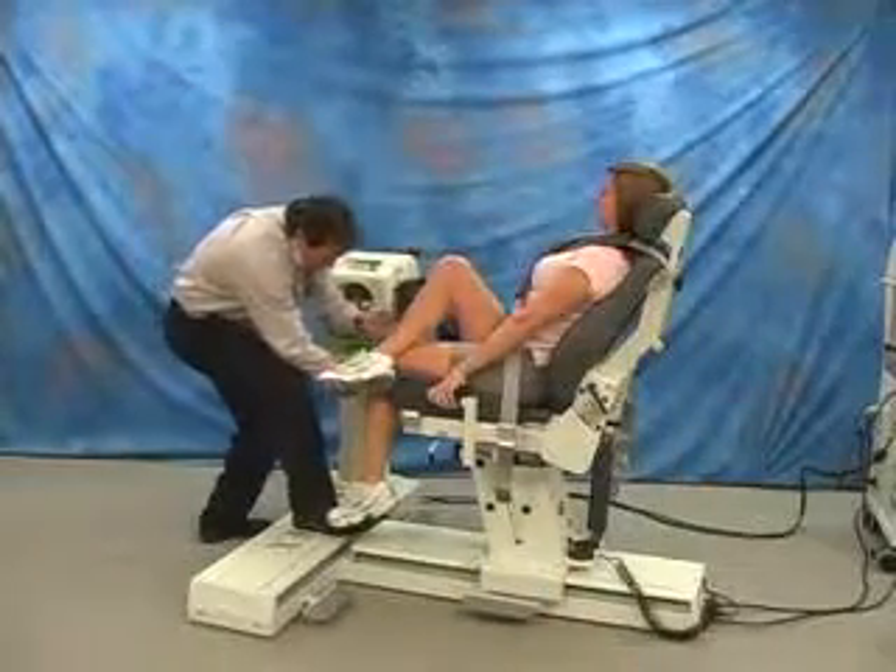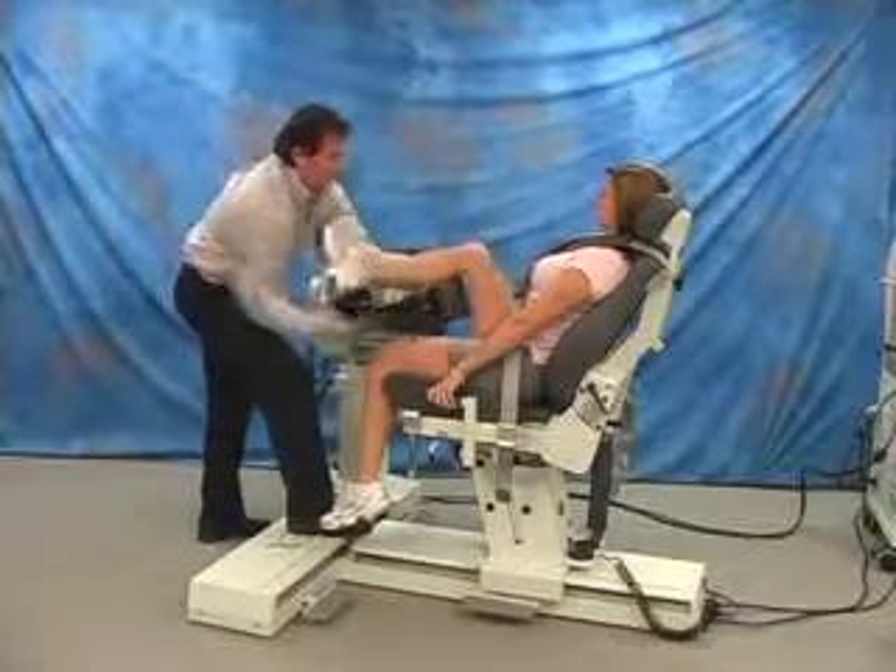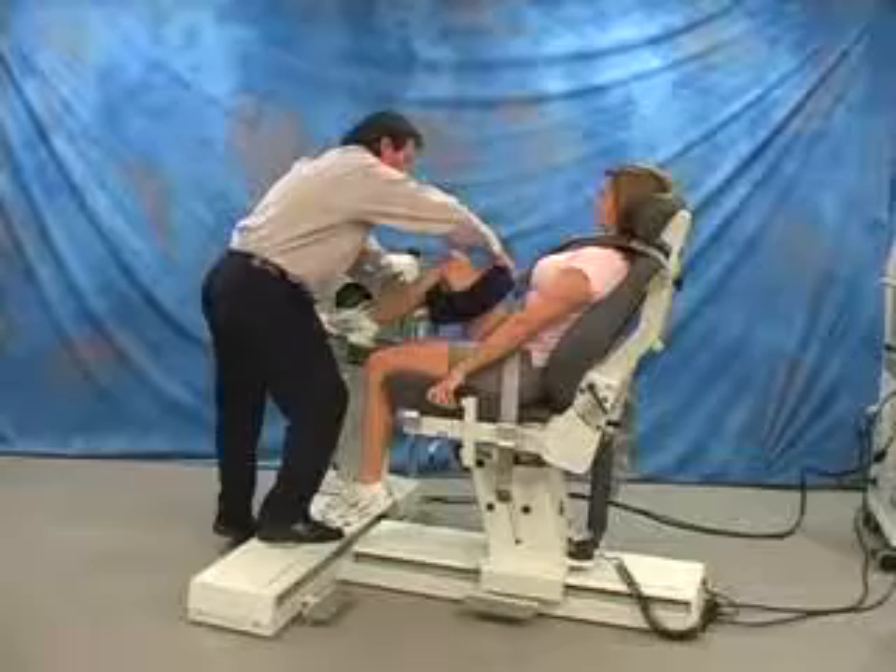Install T-Adapter in limb support, angling the support towards the chair. Attach patient to limb support.